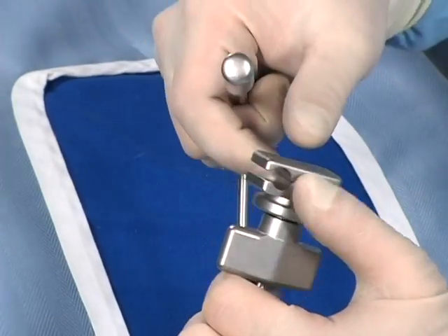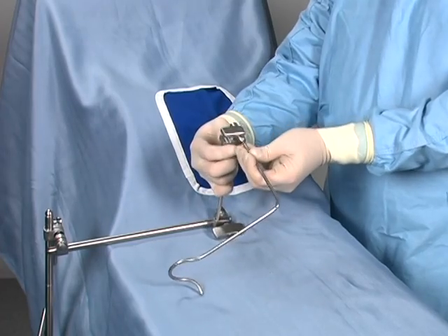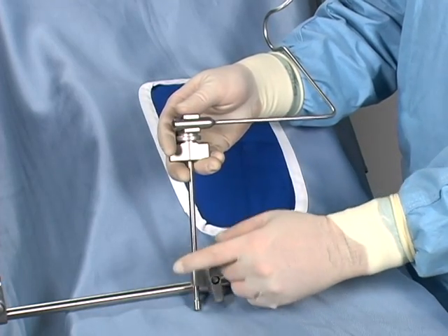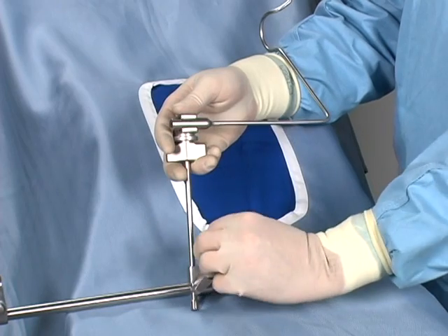Note that the jaws of the holder can accommodate various types and sizes of laparoscopic instruments. Position the retractor and lock the extension arms into place. The distal arm can be quickly adjusted as needed.